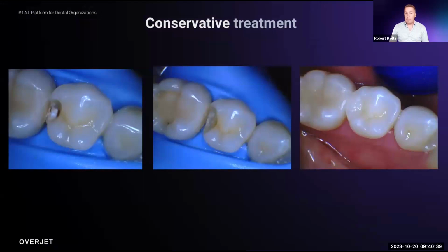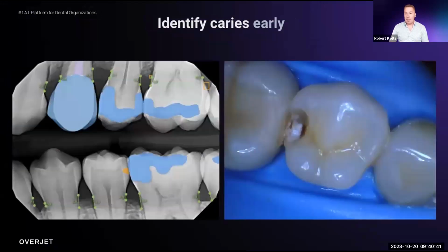But what do we know about the disease process for caries? Is that lesion going to get smaller? Definitely not when it's this size and it's beyond the DEJ already, right? In fact, sometimes it can spread quite large. It would have, in 6 months or 12 months when he was due for another X-ray, it would have at least been a larger restoration. Could have been a crown, could have been causing issues, symptoms, root canal, all those things. And so this is how we can provide higher quality of care for our patients.